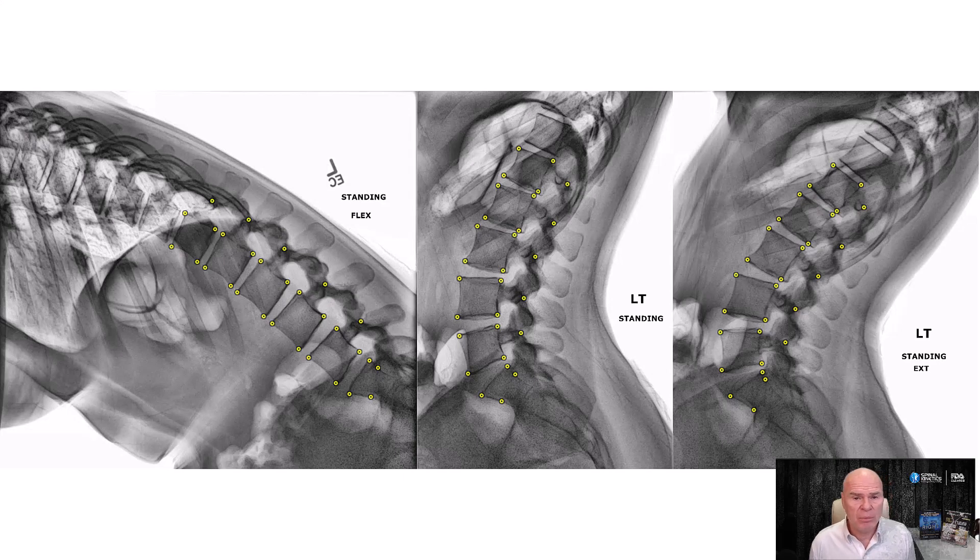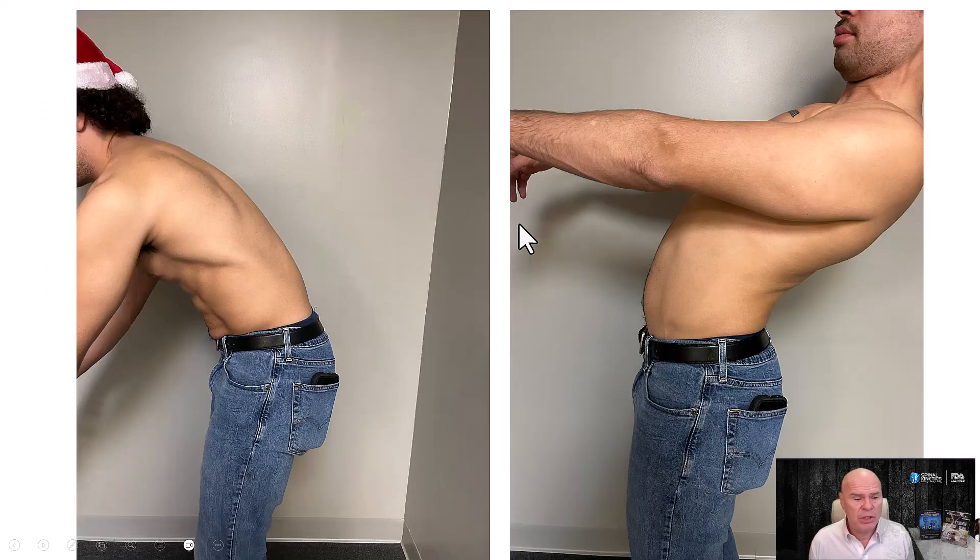Now, in the lumbar spine, these are good images. This is flexion, neutral, and extension. The positioning on those is important.